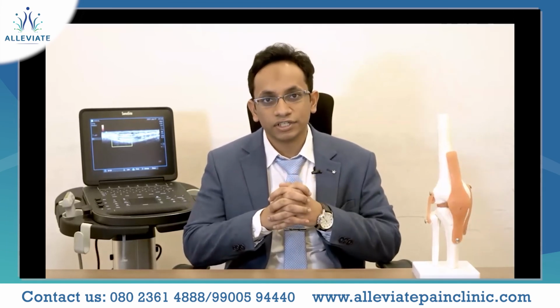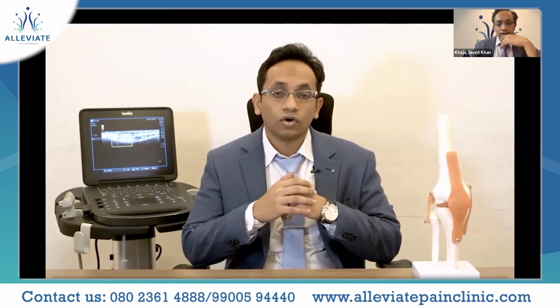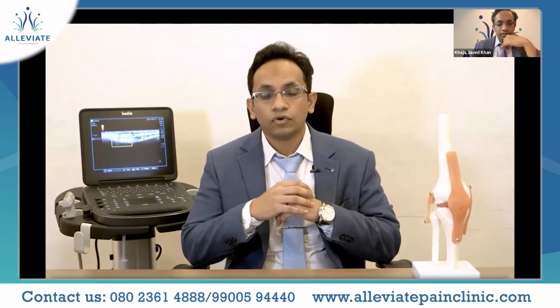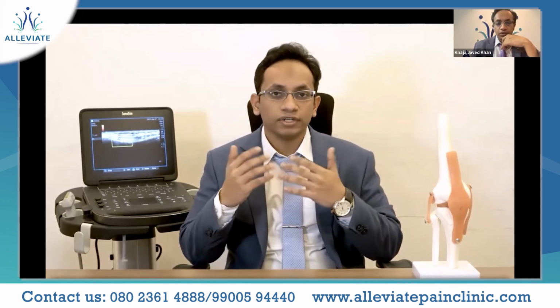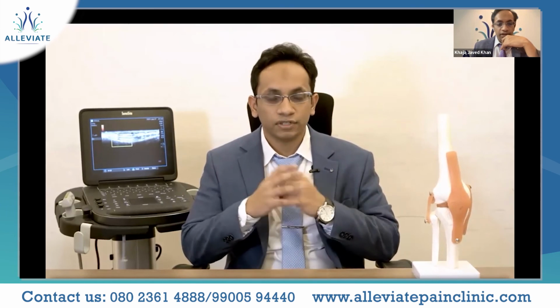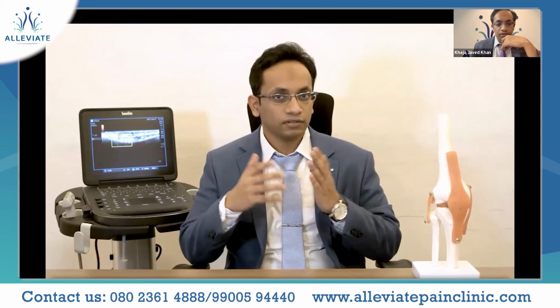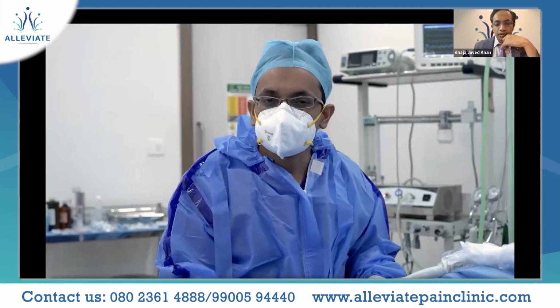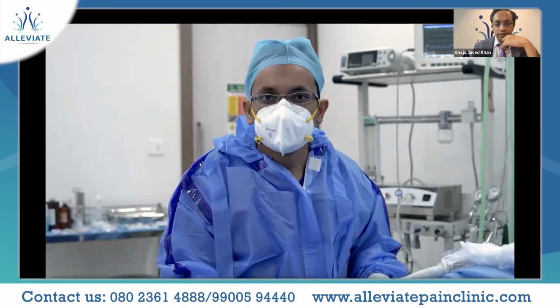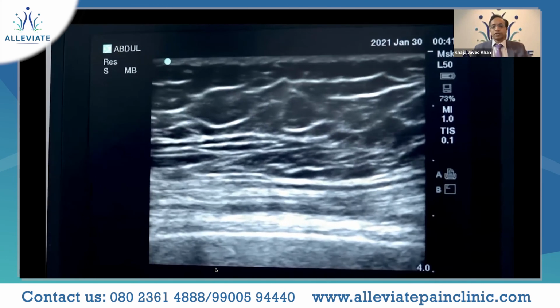Okay, fine. So basically, this is on the knee ultrasound. What we are doing, as I was telling, a patient who had come in with knee osteoarthritis. So we'll be looking at how we have done this procedure under the ultrasound guidance. So this is me inside the OT. The patient is in supine position, and with sterile aseptic precautions, we're going to start the procedure.